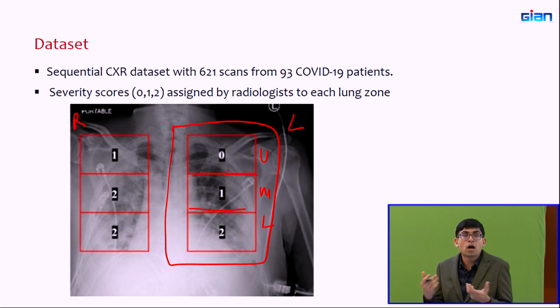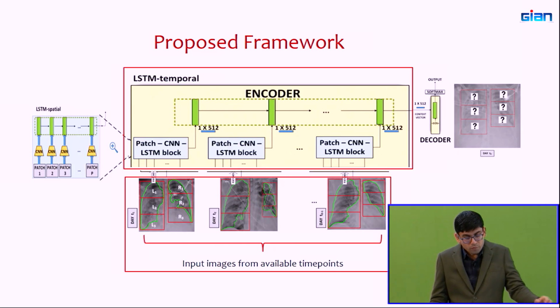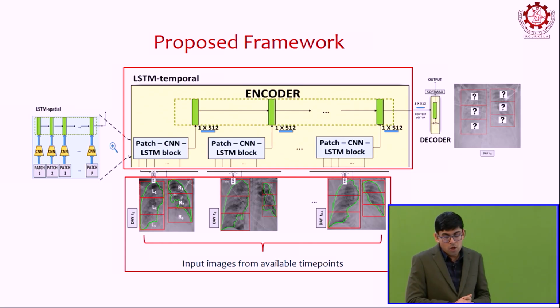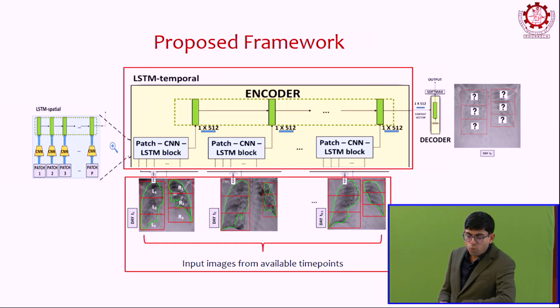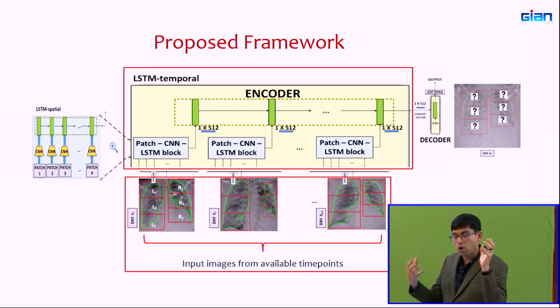And you can imagine how much time consuming this is, right? Now, what did we do here? So what sort of a model did we develop? We developed an LSTM based framework, a long short term memory framework. What this framework does at a very high level is it retains in memory what it saw previously, and it brings in the new context.